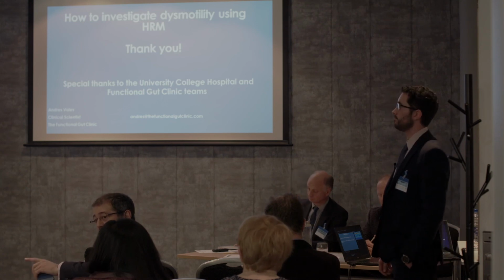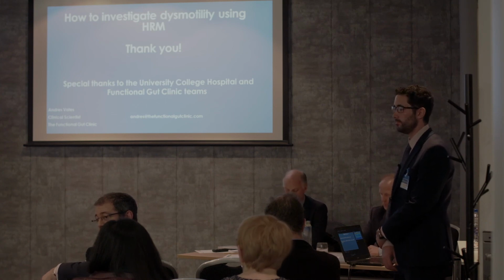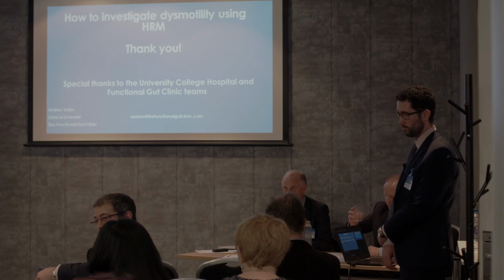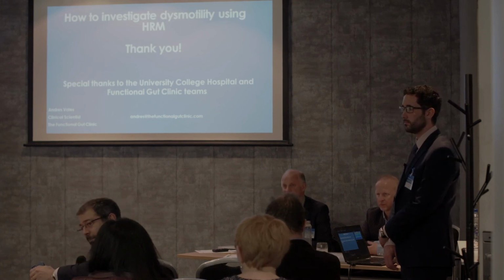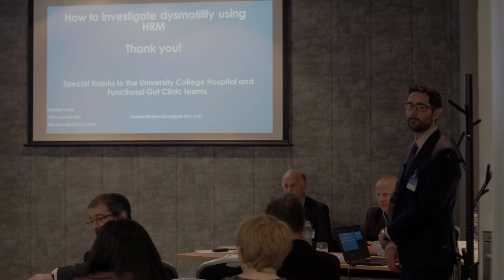Now, there's also the other caveat of whether or not you have a hiatus hernia. And if you've got a big hernia, whether or not you put the marker within or outside of the hernia. Ideally it should be outside. If you've got a very big hiatus hernia, like 6 centimeters, and you should be distal to the intrinsic lower esophageal sphincter by about 3 centimeters, it's not uncommon to place the gastric pressure marker within that hernia.